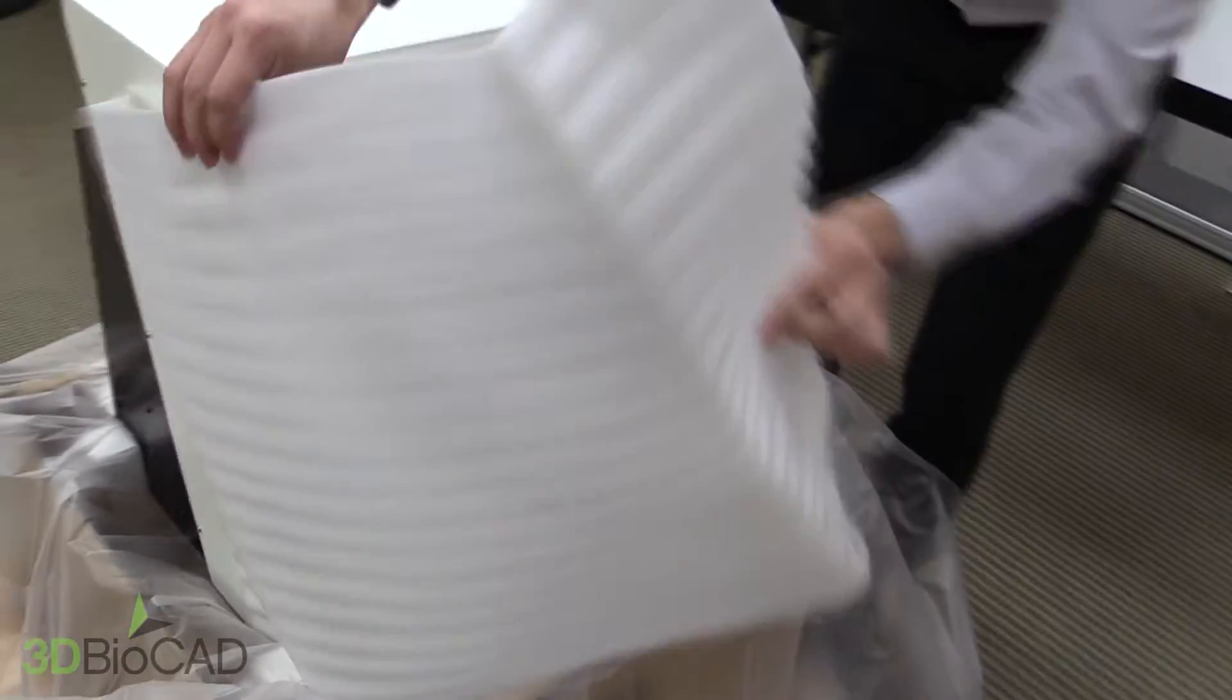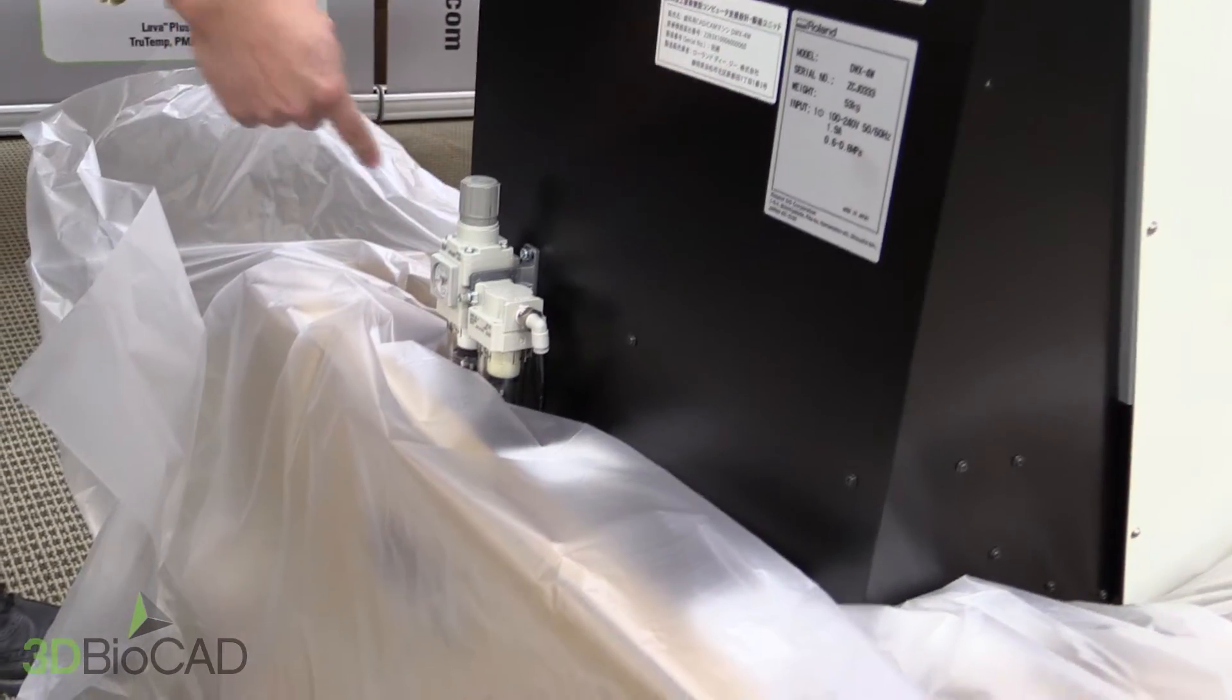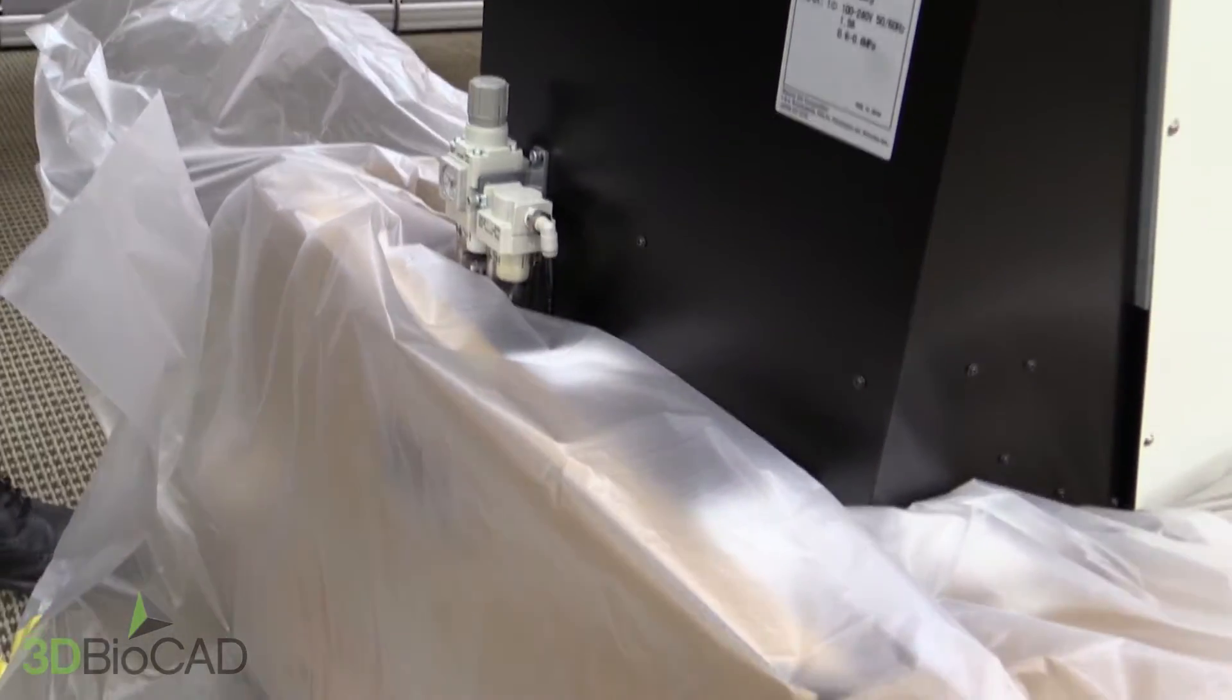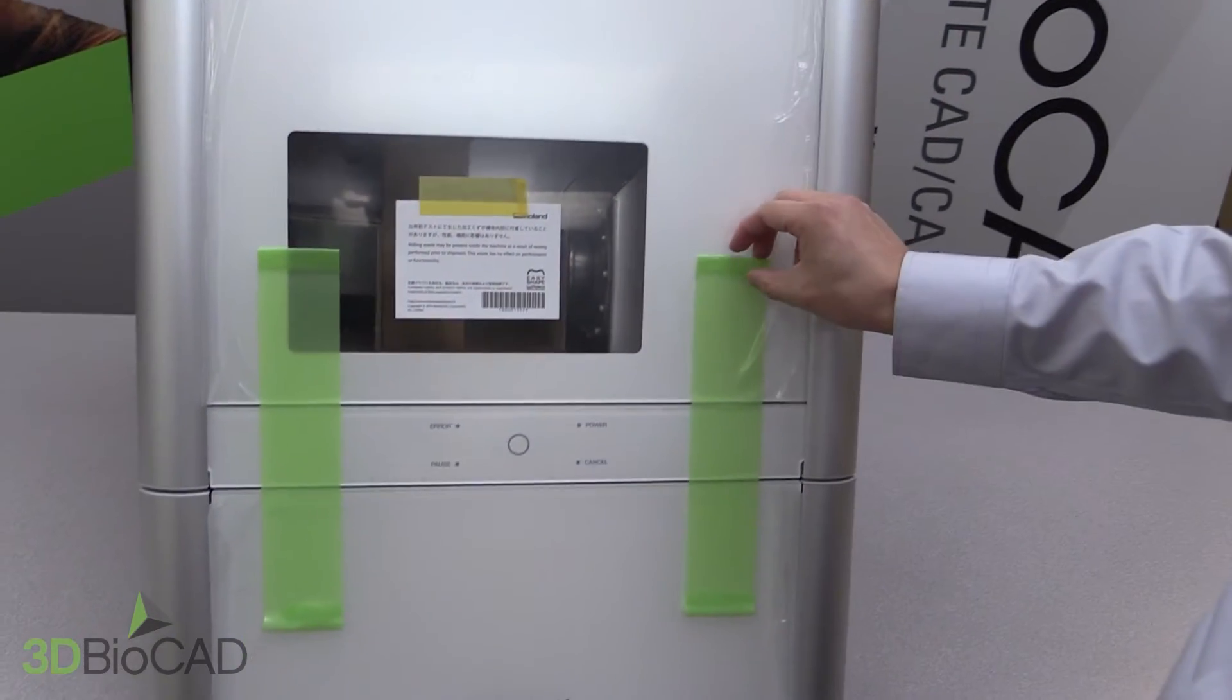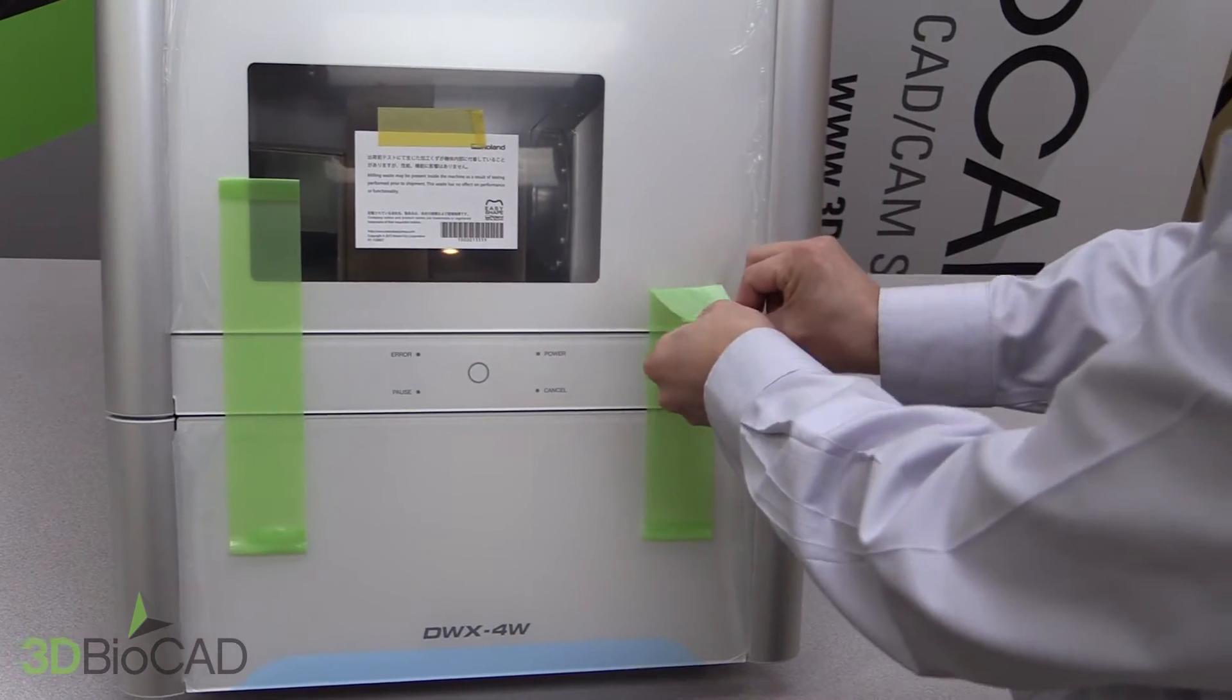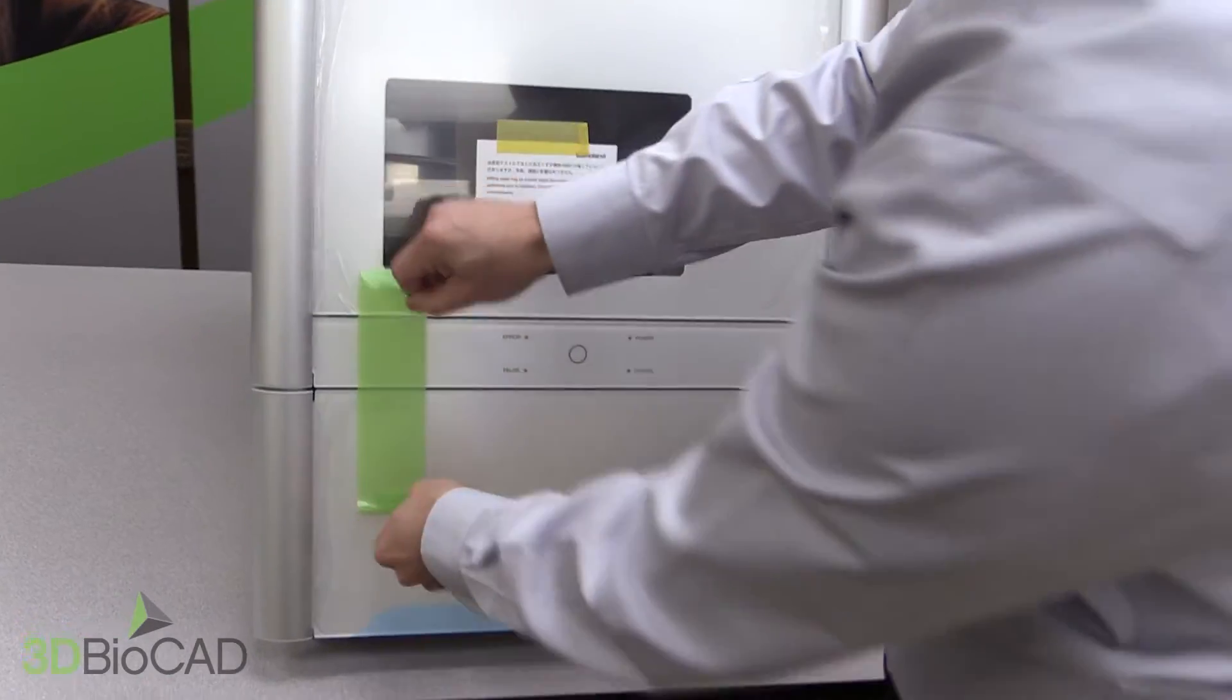Be cautious of the air regulator on the back of the machine. Remove the DWX-4W from the box and place in the designated workstation and remove the green tape securing the door.